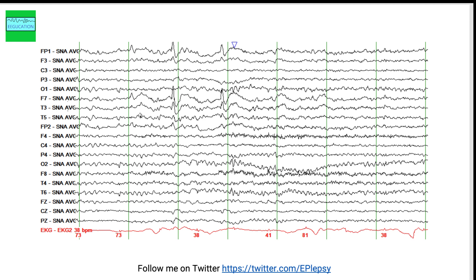In your clinical correlation, you would say these findings are suggestive of a focal disturbance of cerebral function involving the left frontal temporal head region, and correlation with neuroimaging is recommended. You would also note that considering the sharp wave discharges in the left frontal temporal head region, this person is at high risk of having ongoing seizures.